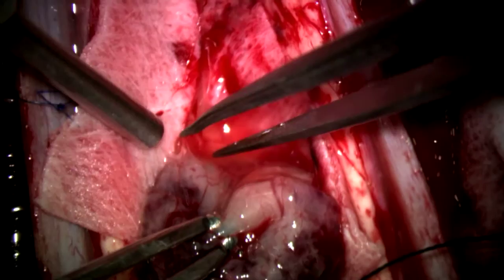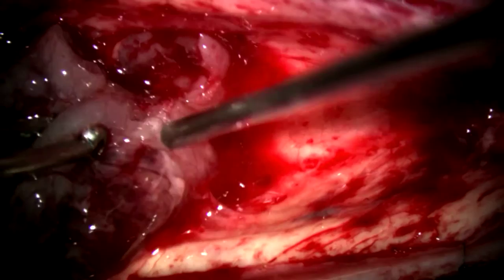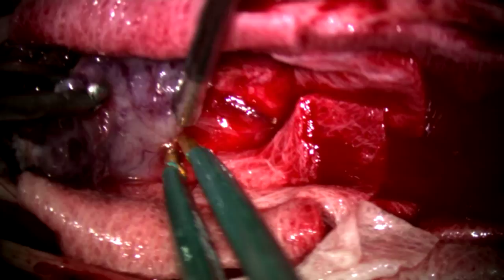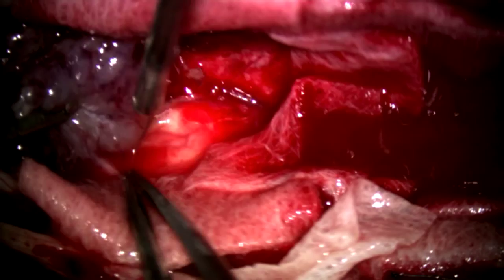Afterwards, we just minimized the size of the tumor in order to prevent rough manipulation of the heavy tumor on the cord. Going further with the irrigation dissection technique, as we can see, the blood supply of the tumor is coming from anterior. Very important is to preserve the anterior spinal artery during dissection of the tumor.